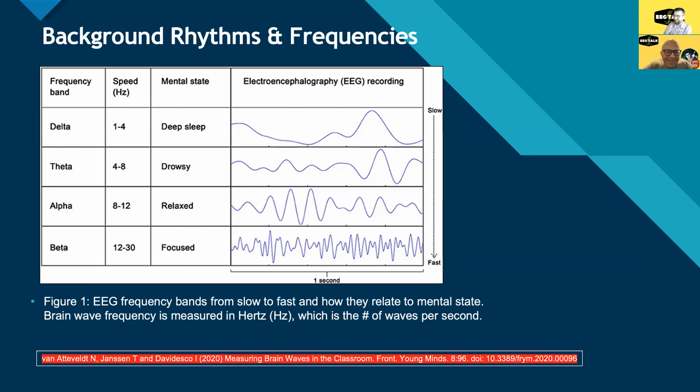Let's do it. So let's just start with the basics here, just a reminder for everybody. These are the four frequency ranges we usually use in EEG. Is that right? You bet. Okay. Delta is 1 to 4 oscillations per second. And it says here it occurs in deep sleep. That's true in normal deep sleep, but it also occurs in severe encephalopathy, as we'll see.